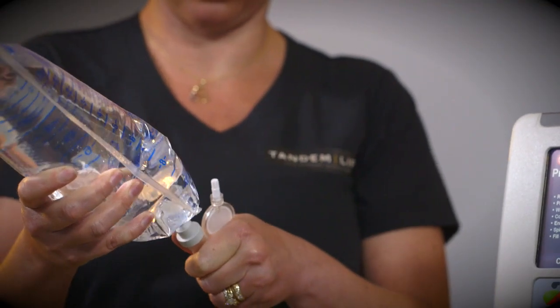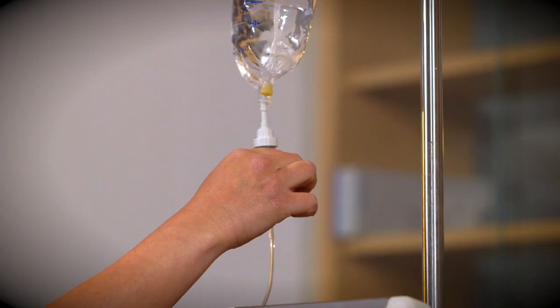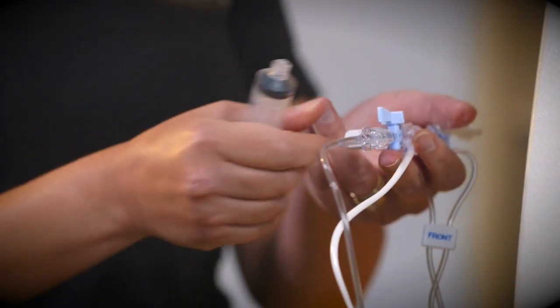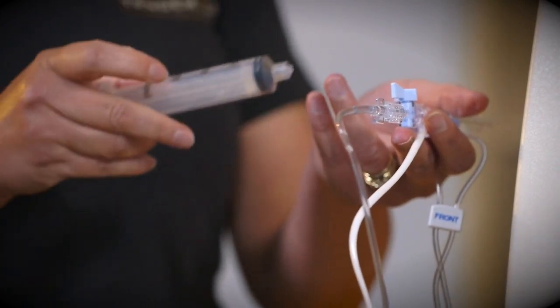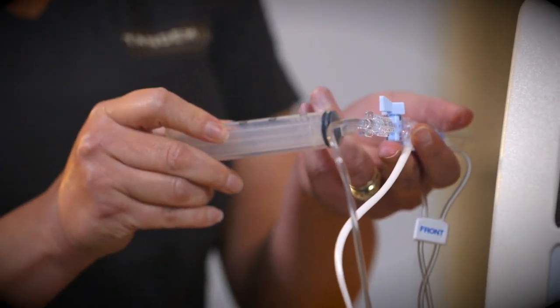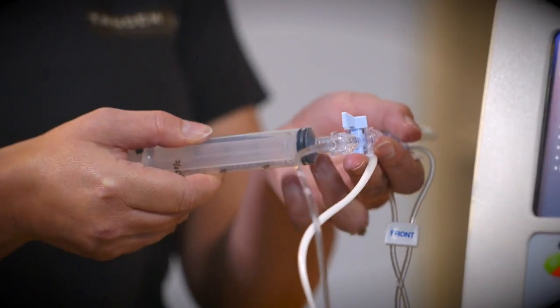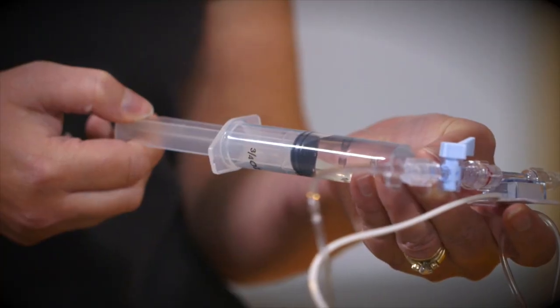Spike the saline. Fill the drip chamber two-thirds full and verify the infusate. To prime the lower housing, connect a 20 cc syringe to the stopcock. Open the stopcock to the IV bag and fill the syringe.